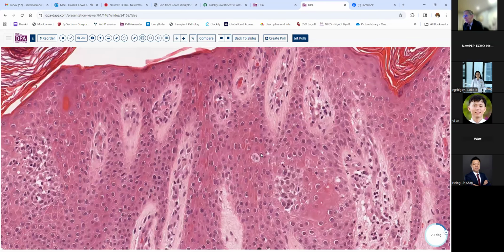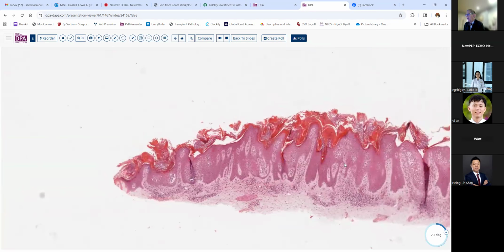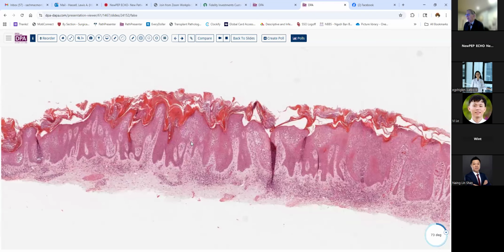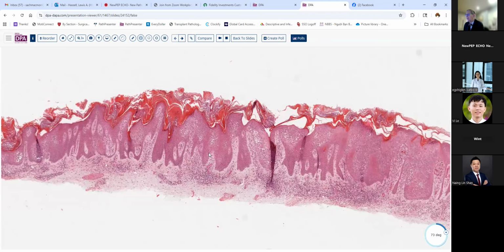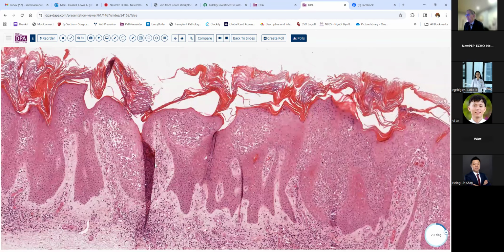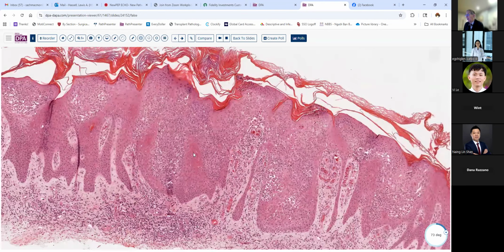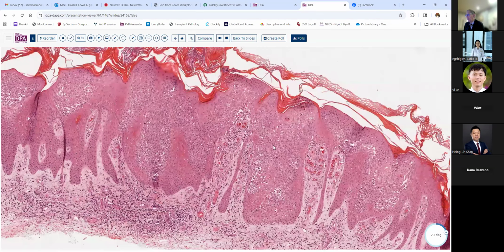This may actually be a mitotic figure there. So we found one mitosis. But most melanocytic lesions are not usually associated with this degree of acanthosis. There are some that can, some of the nevi will show that pattern. But taking these things together, hyperkeratosis and this sort of clonal, more squamous type of epithelium, it begins to fit into the pattern of what is called an irritated seborrheic keratosis with sort of clonal pattern growth.